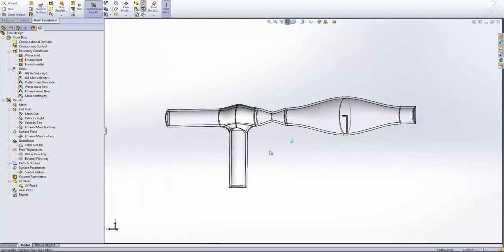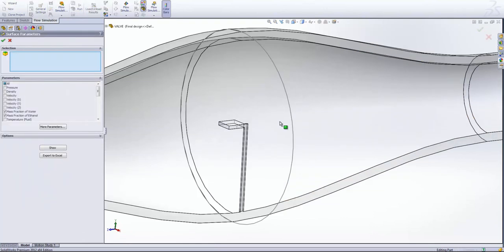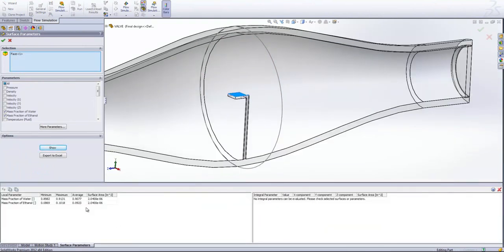Finally, one thing that we will briefly have a look at is the parametric study. While we've improved our design to this point, we may still be looking for our mass fraction value to be more precise. If I have a look at the surface plot on our sensor and select each of these two faces again, you'll see that our mass fraction of ethanol is very, very close. It's much closer to that 0.1 that we're after, but we're still not exactly there.